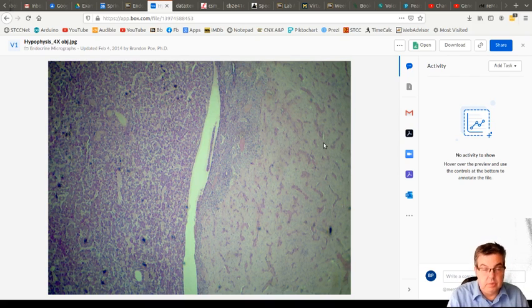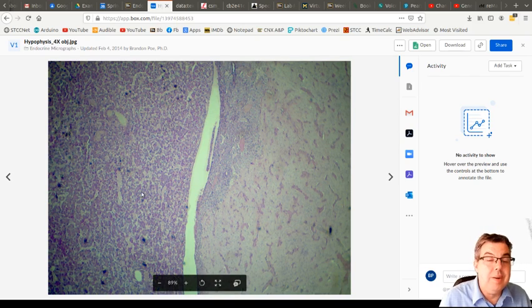Glandular tissue to connective tissue to nervous tissue, that sort of thing. So it's going to preferentially crack right there. We'll often see that cracks in tissue fall where there's some obvious line between it. But I just want to point that out here. So one side of this is essentially darker and the other side is lighter.